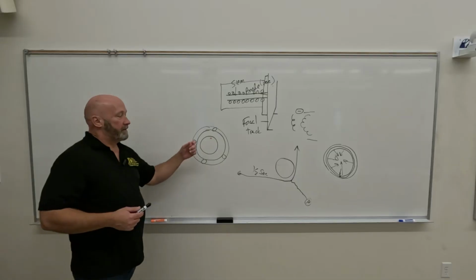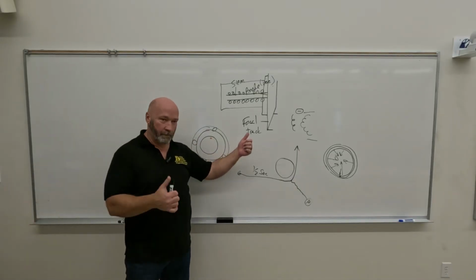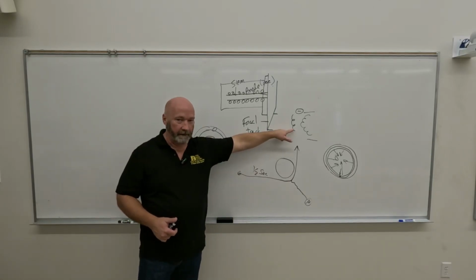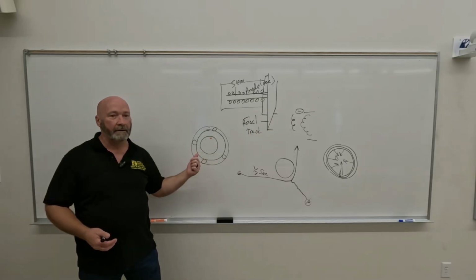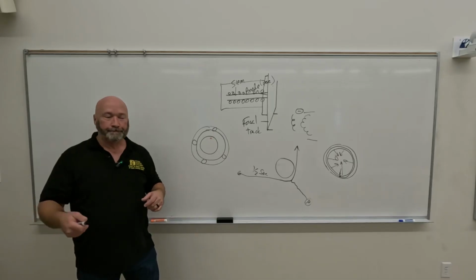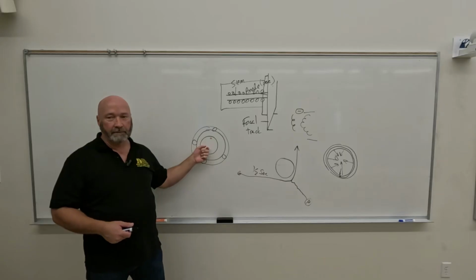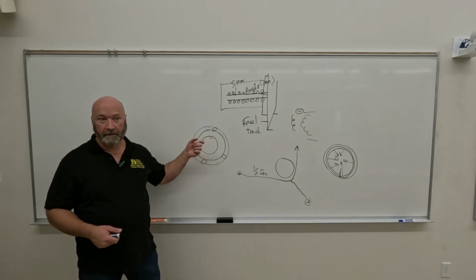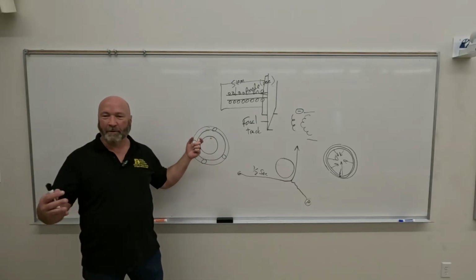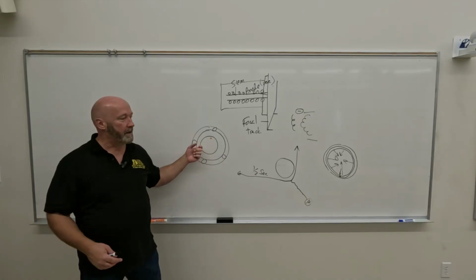So your induction motor is going to do two things. We've talked about one of them. When we push the prep button, we get heating of the filament to create a space charge, and we rotate the anode from 0 to 3,400 RPM in about a second, right? But we make the exposure, and what you don't hear is this thing rotating forever. It would. I've worked with a machine. All these problems I'm talking about with the machine is one machine. It was a great machine, but it had quirks.